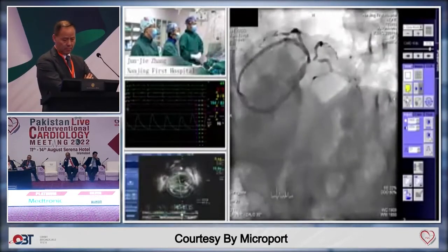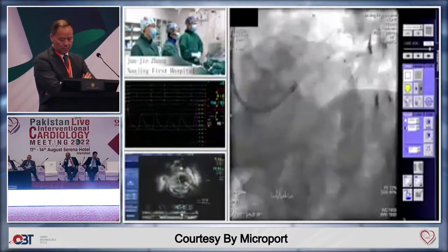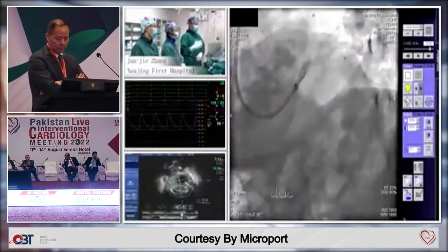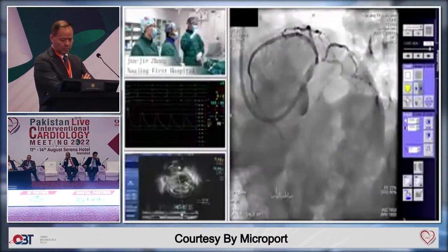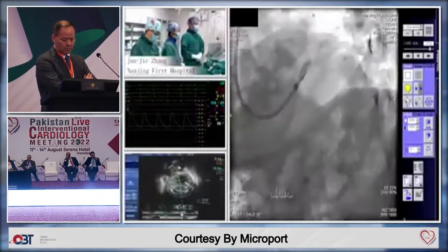For distal left main, I think the traditional spider view can show the distal left main 2 bifurcation lesions. And considering the OM is a larger branch than the distal circumflex, from this view, we consider the circumflex to OM as a side branch for the stent deployment. Next.